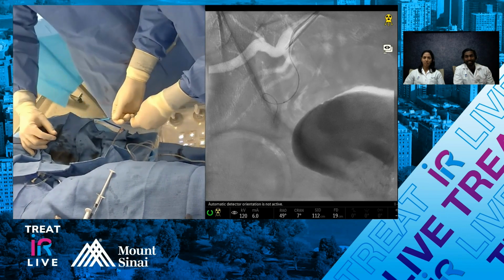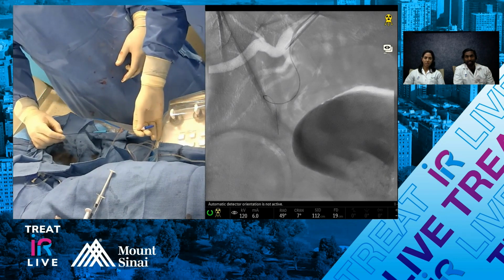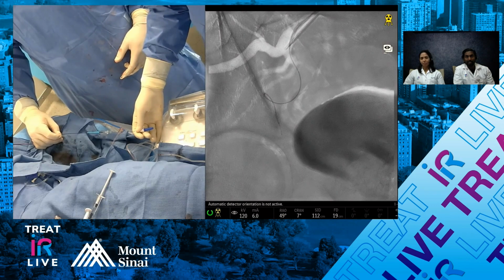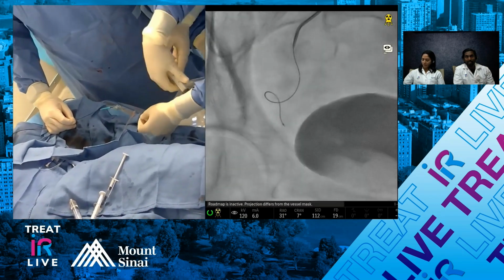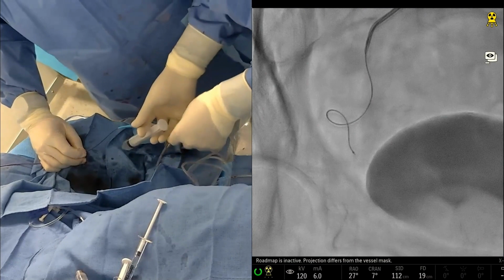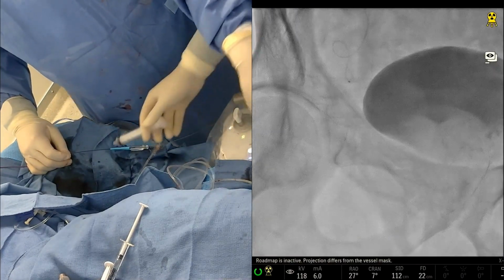That's great. Yeah, so there's your loop, right? You know you're in the prostate when you see a loop like that. And I'm not even really pushing, I'm just sliding it. You guys can see it's with one hand. It doesn't really require a lot of effort with the True Select. So we love the True Select for that reason. Again, I like the Sniper, but I don't like it for that origin because ultimately it's going to be a little too stiff and it might create an issue.